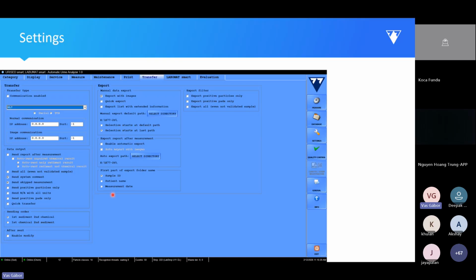So you modify the sample. If you enable this feature, the modified sample will be sent again to the LIS and will be dealt with on the LIS, how the LIS is programmed for that. I believe there are not too many laboratories who require this, but if you do, you have the option.